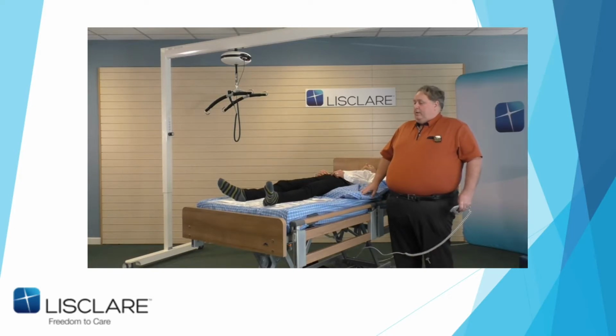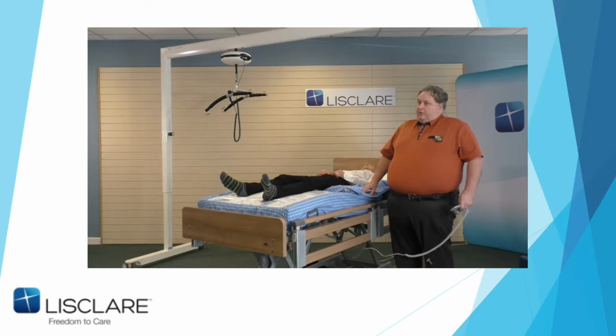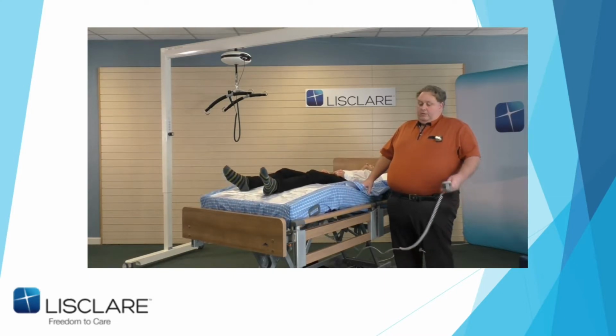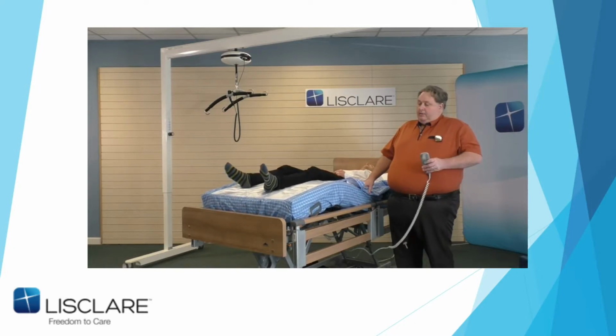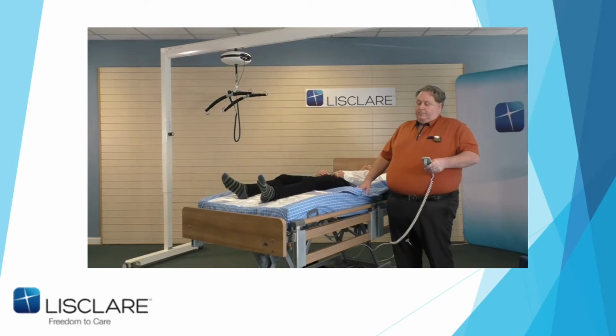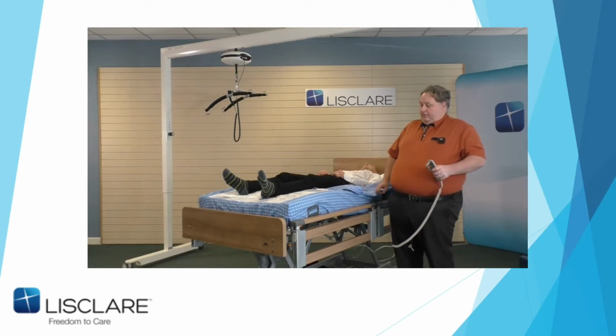Not easy to say. Now again, during this demonstration, you'll see John's feet stand down. And if I want them to rise, what I'm creating is actually a slight slide, but then when I lower that down, you'll hear a few clicks. And you should hear another one. There it is. So when I press up, it elevates the legs slightly, okay?